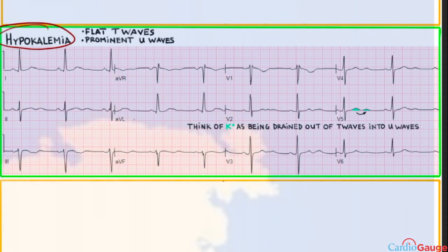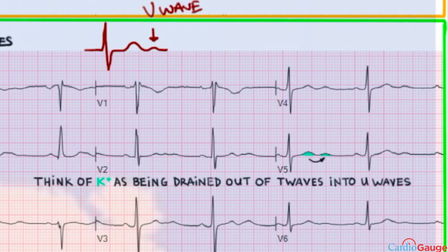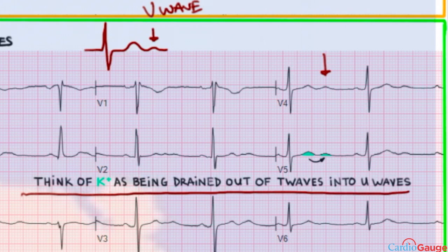Here's mild hypokalemia. The features are flat T waves and prominent U waves. U waves come after the T wave and reflect repolarization of the His-Purkinje system. You can see a T wave here and a U wave here on the ECG. You can think of it as the potassium being drained out of the T waves and into the U waves.